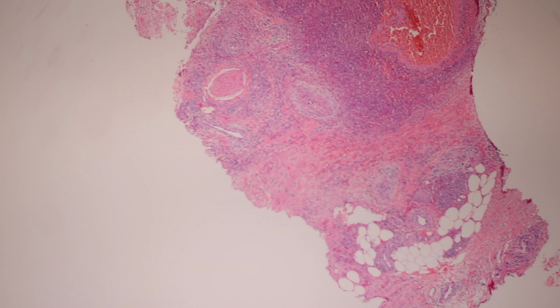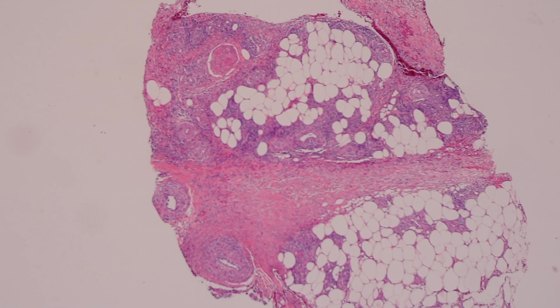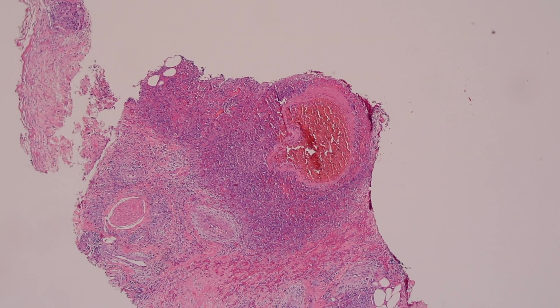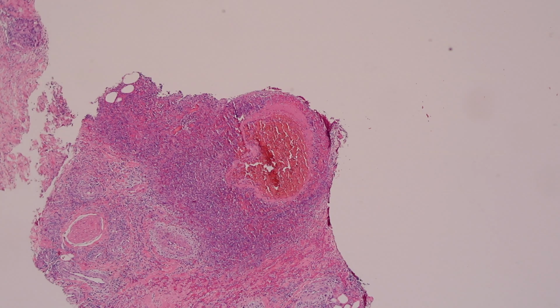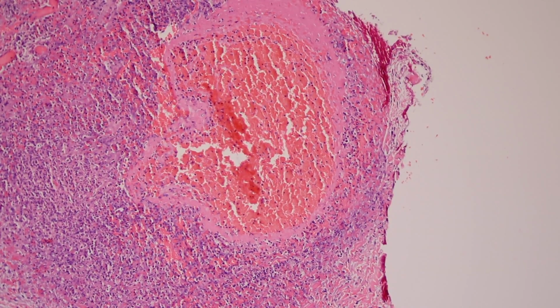Now we said that if you see deeper involvement, to think of systemic disease, if you see EOs, if you see granulomas, which we haven't showed anything with granulomas yet, but those things can all make you think of systemic disease. And most of the vasculitis, or all of them that we've looked at so far, focused on the superficial or superficial and deep dermis, really. But this is a case where most of the inflammatory action is going on at the dermal subcutis junction, or even within the subcutis. And it's all centered around one big dilated vessel here that's been basically totally destroyed by vasculitis, by inflammation.